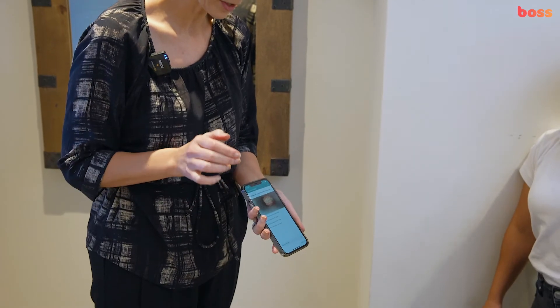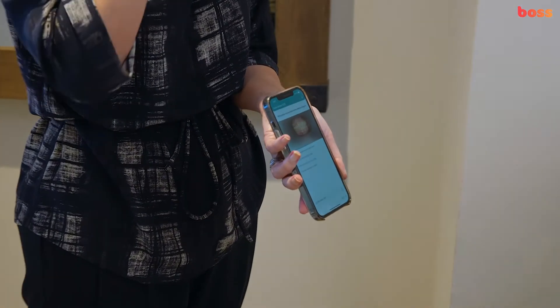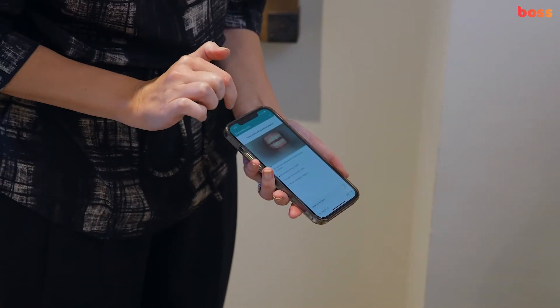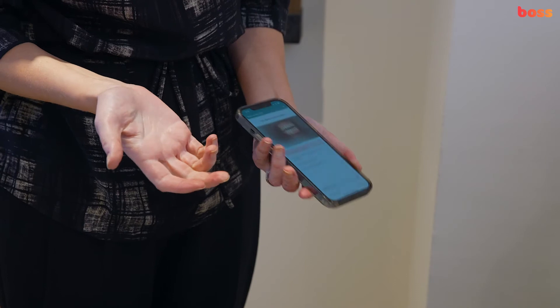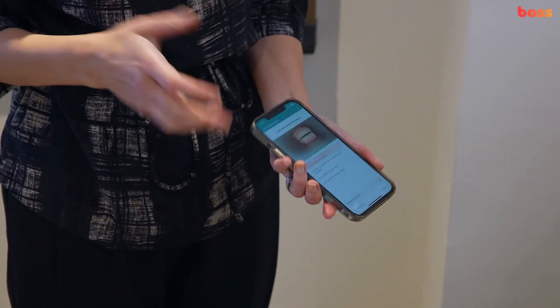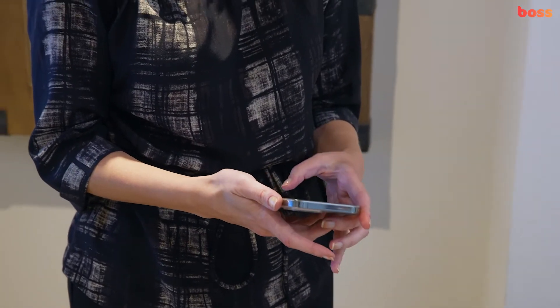Then you can do a review — start the review. You can see how before you saw the nose and the lips and the cheeks, but now all you see is teeth. It's telling me it's all looking good. Next one — all looking good. And next one — obviously it's picked up on the fact that I don't have aligners in. Once that's done, you send it through.